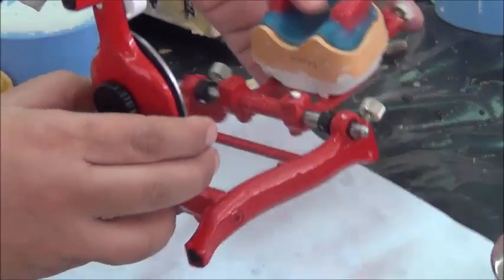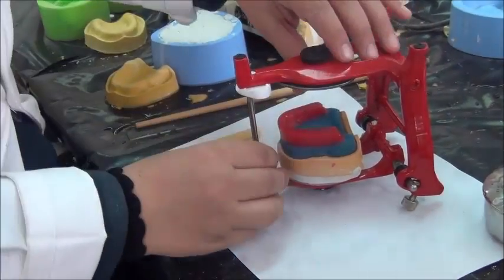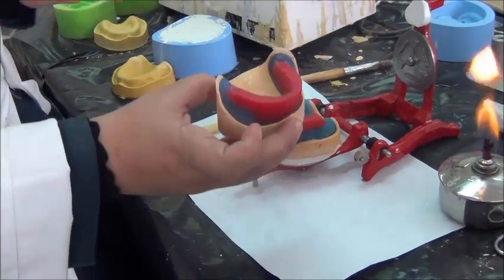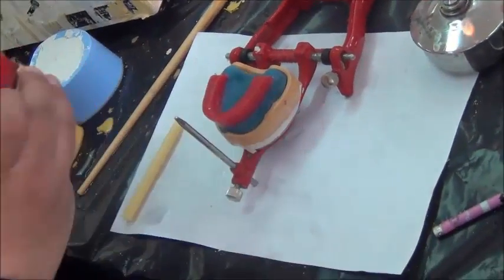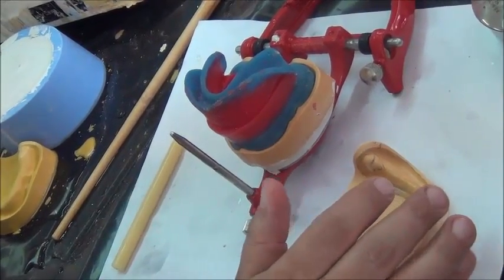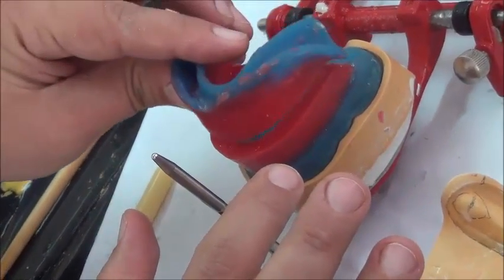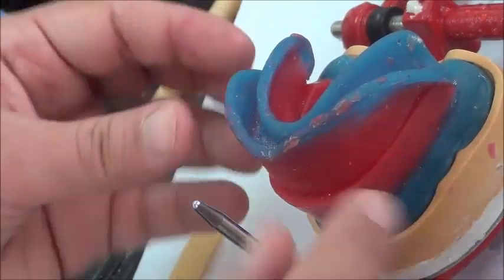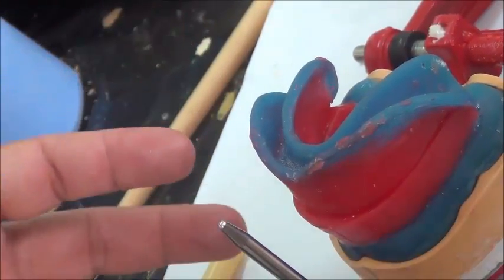For the lower to be mounted, first we're going to invert the articulator. Now it's upside down. And we're going to place the lower according to measurements. So we are still using the average mounting. But if this was a patient case, we would have the upper and lower wax rims fixed from inside the patient's mouth. Inside the patient's mouth, after we adjust the upper wax rim and everything is okay, we add the lower one, let the patient bite with a sticky material in between, and this will hold it in place. But in our case, we don't have a patient, so we're going to put it in an average.